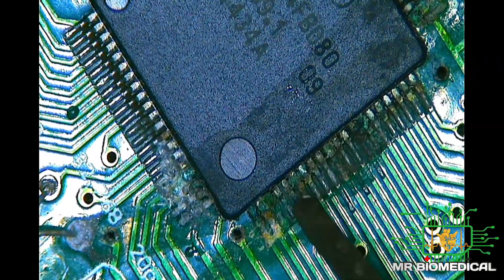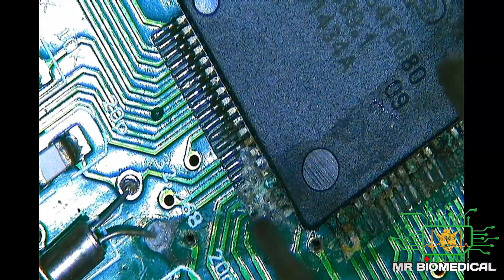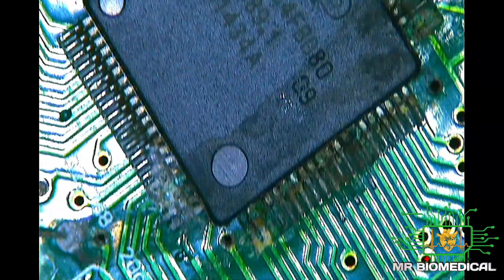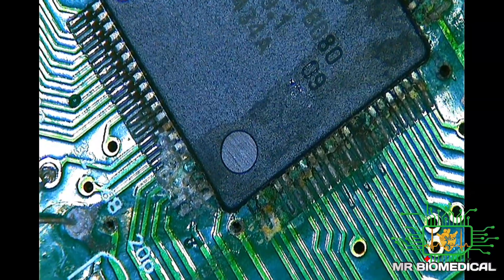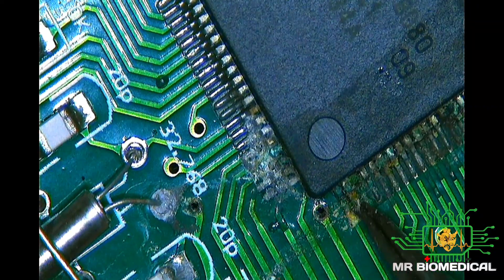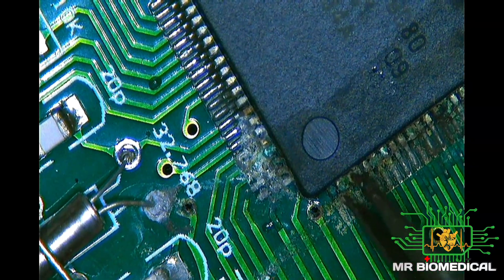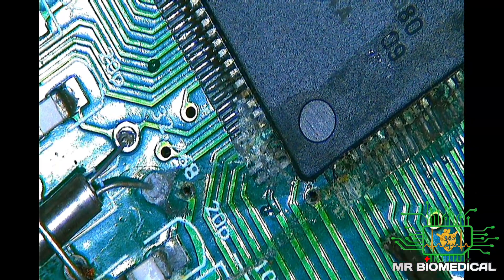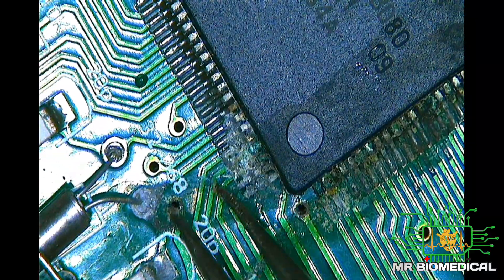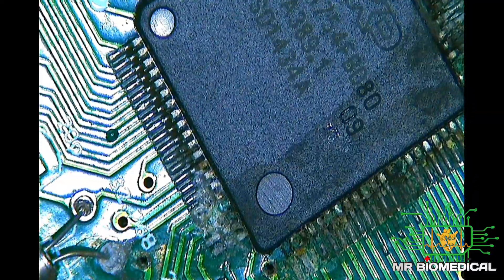I can see corrosion on this main IC — on this side here — while this other side is fine. What I'm going to do is rework this IC, put it back, and see whether the problem is resolved. First, I need to remove the IC from the motherboard and make sure the PCB track is intact. If it's not, we'll need to solder the connections to ensure every pin is making a good connection with the pad. Let's go through this step by step.